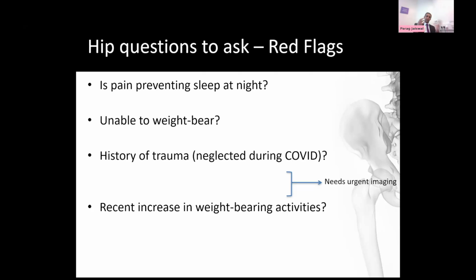So you can have an MRI suggesting hip impingement, but you can also have a hip flexor origin tendinopathy, particularly of the rectus femoris. Under those circumstances, I tend to do a diagnostic injection of dye, steroids and local anesthetic into the joint with an EUA, an examination under sedation rather than anesthesia. I take the hip through different ranges of motion to see where it's impinging and what kind of pain response they get. Hope that answers your question.